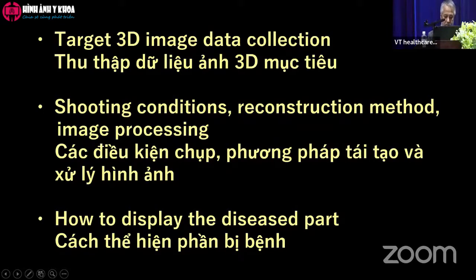The items shown on the slide are required to create a 3D image. Reconstruction and image processing are important after imaging. Few 3D images are designed in one click. Therefore, the original image is most important for 3D imaging and its major progress, so that the imaging condition and the contrast enhancement condition are suitable for the purpose.